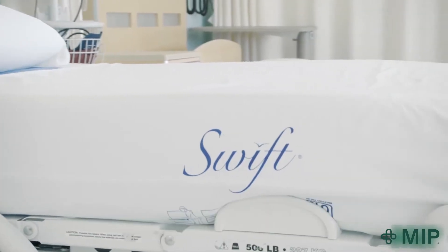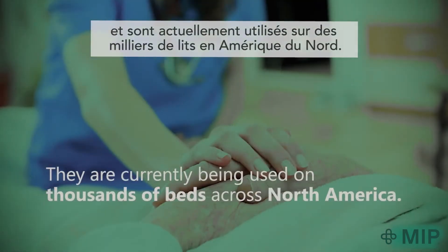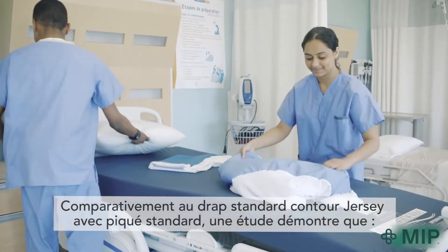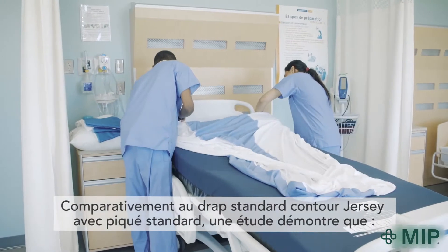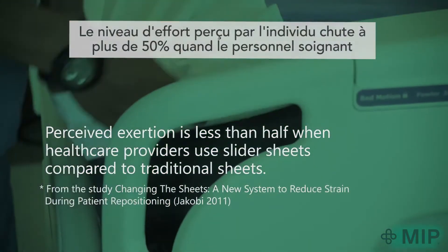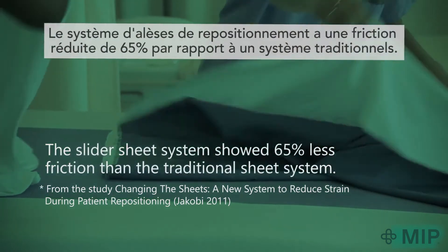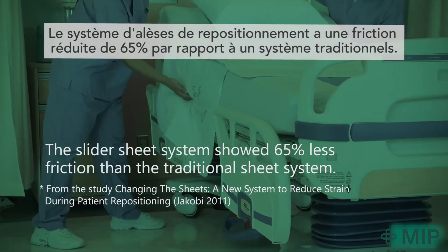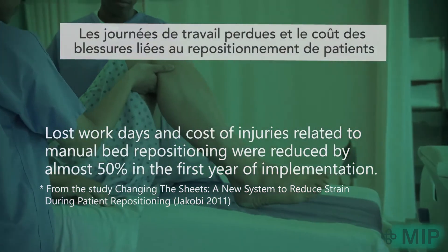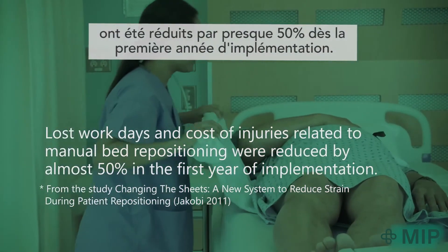And just how effective is the Swift Ultraslide system? Our sheets were independently tested with caregivers at eight hospitals and are currently being used on thousands of beds across North America. Compared to the use of a standard jersey contour sheet with a standard bed pad, an independent study shows that perceived exertion is less than half when healthcare providers use slider sheets compared to traditional sheets. The slider sheet system showed 65% less friction than the traditional sheet system. Lost workdays and cost of injuries related to manual bed repositioning were reduced by almost 50% in the first year of implementation.